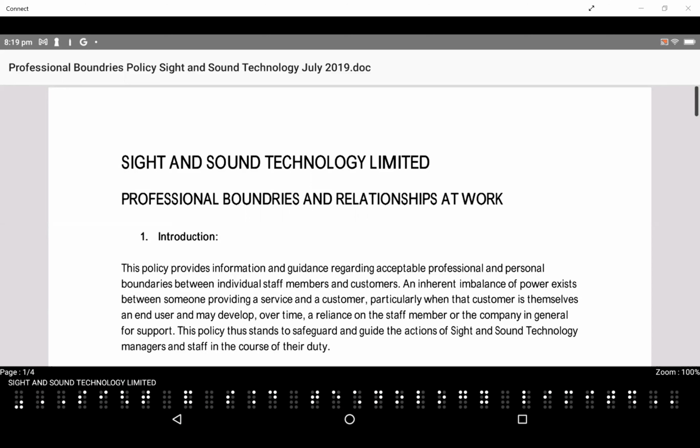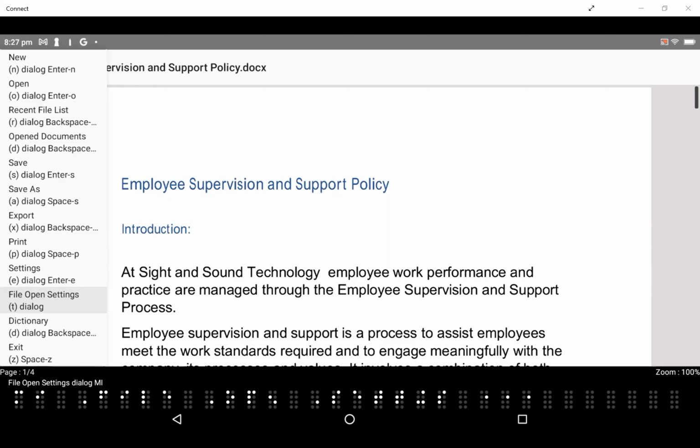I have never switched it to open the whole document because by default it's open document immediately and be opening in the background. Again, certainly for the Polaris, that's going to be a setting you want to keep in its default state. Maybe for the BrailleSense 6, you may find that that's not the case, but it's not something I have played with a whole lot.